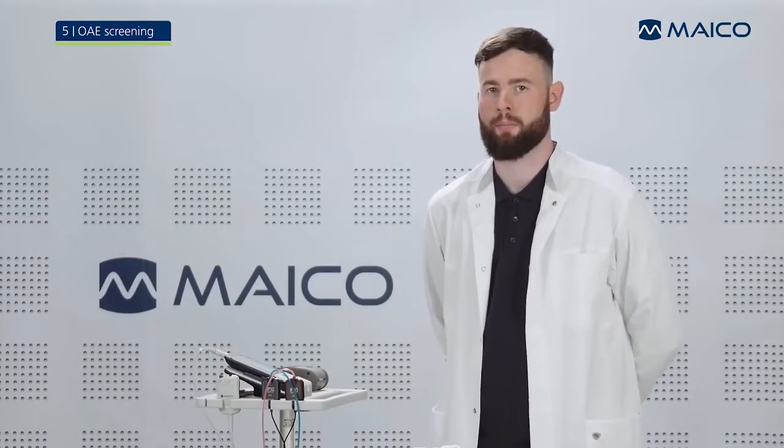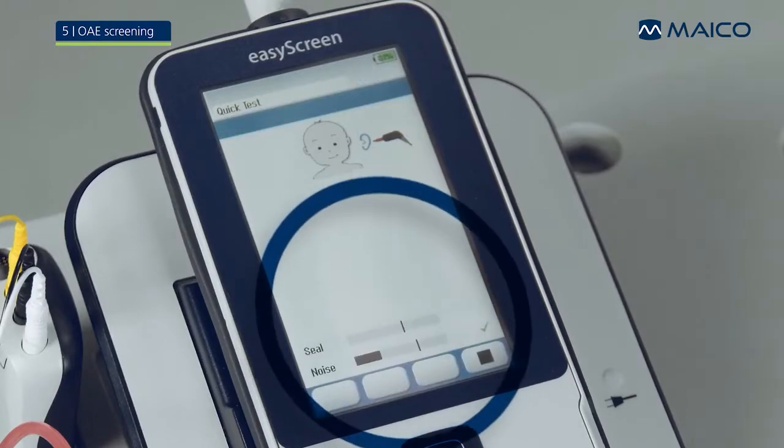Start the TE-OAE or DP-OAE screening by touching the start button. After an initial probe fit check, the EasyScreen begins the measurement and shows horizontal bars providing feedback about the fit of the OAE probe and noise interference. A green check mark to the right of the bar indicates that the test condition is alright.